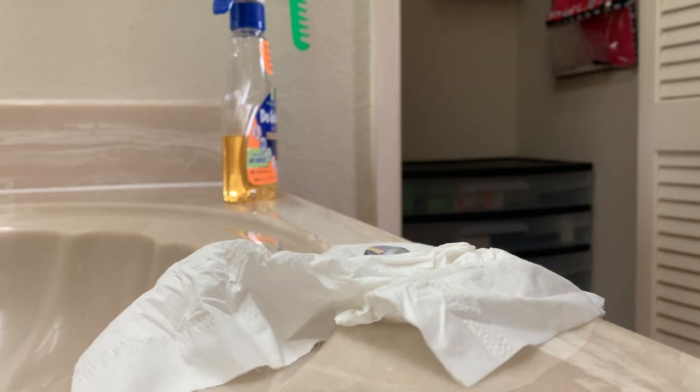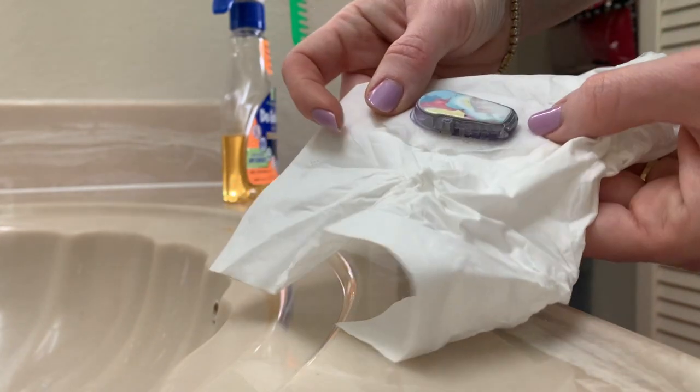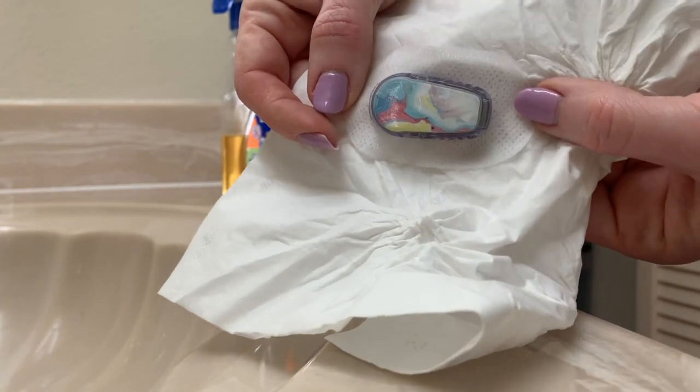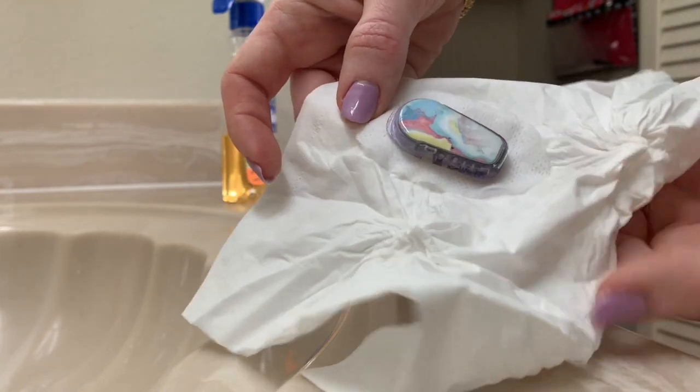Hey there, just wanting to do a quickie update to show how to remove a Dexcom G6 transmitter from a sensor. You can see I've got the transmitter and the sensor off my body. This one is actually pretty easy.